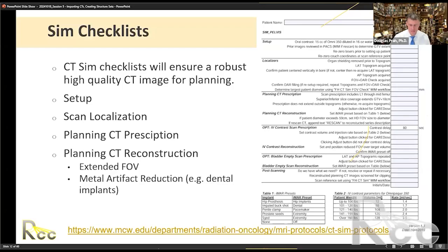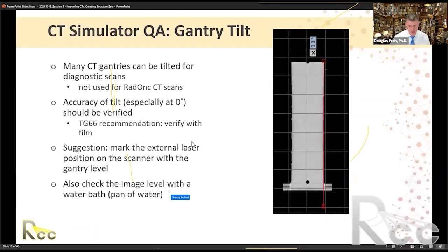So I think one needs to use some judgment in these cases. We've gone through these and we have a pretty good idea of the impact that they have. If something is going to be closer to the target, we might force the density in that area and just use it for target delineation. But it definitely will have some impact on that. And it's important that you understand the impact that your IMR might have on the Hounsfield units. Excellent question. Thank you.